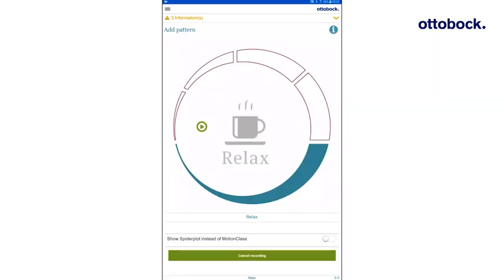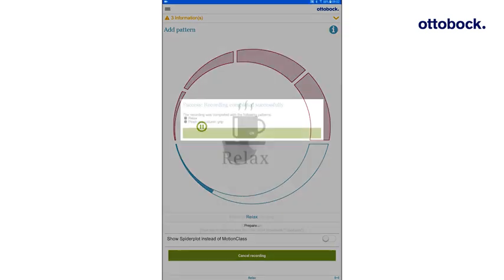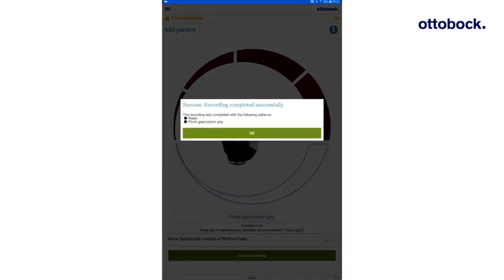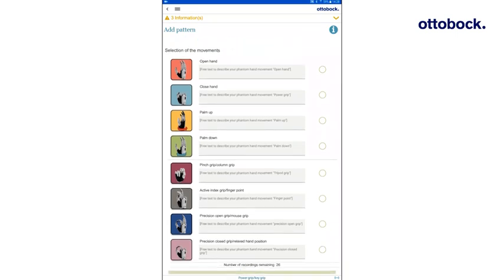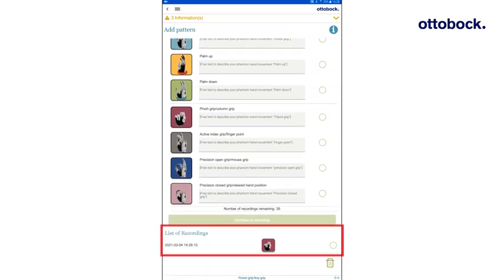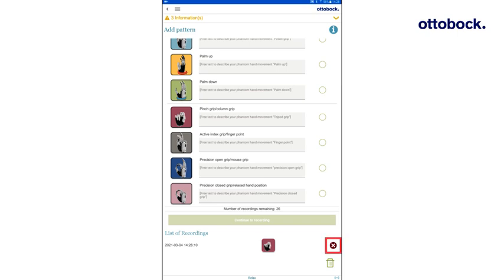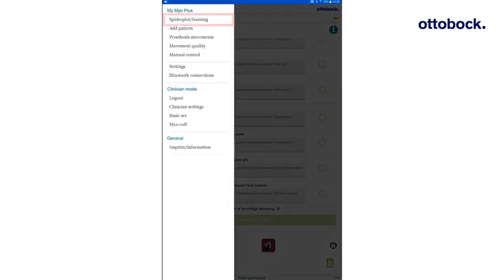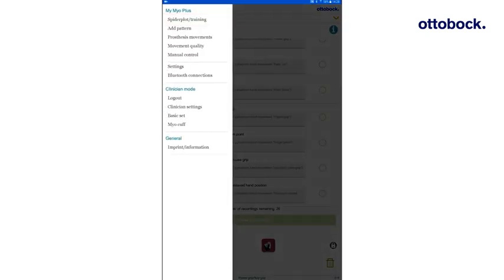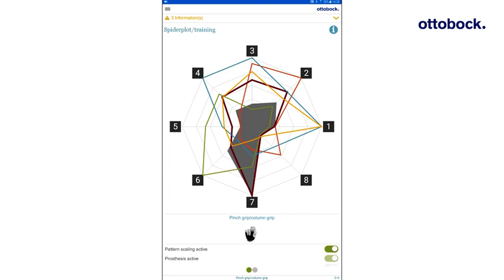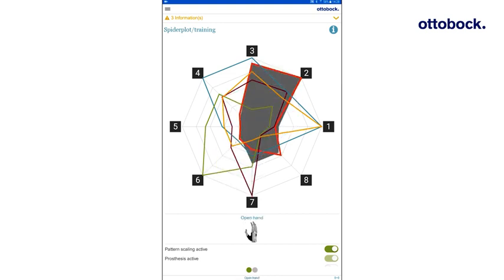Make sure the arm is in the 90-degree bend position like in the test set and start the recording. After the recording, the new movement will appear in the list of recordings. Added recordings can be deleted by selecting the checkbox and clicking on the trashcan symbol. As clinician, it is also possible to lock a recording, so that the user cannot delete it. To do this, click the checkbox twice until the lock symbol appears. After recording, the new movement is displayed in the Spider Plot.